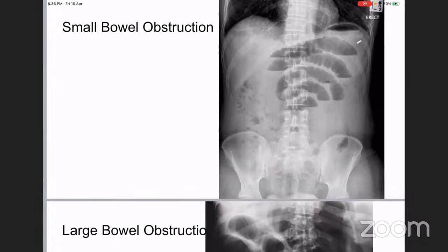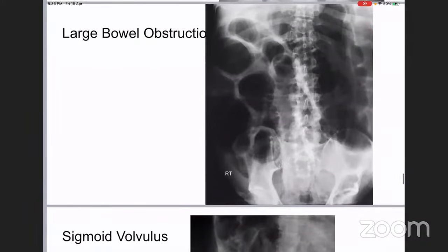Okay. Let us move on to the next radiograph. What do you see here? Again, multiple air fluid levels more at the periphery. Can you see fluid anywhere? I don't see any fluid. You can see dilated bowel. Can you see fluid levels here? Air shadows can be seen. Multiple intraluminal air shadows involving the periphery, signifying dilatation of the large bowel.